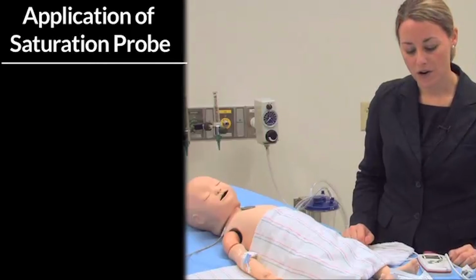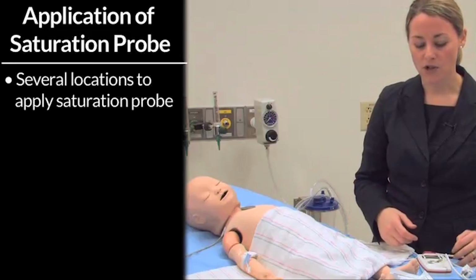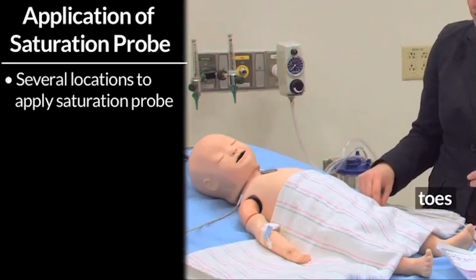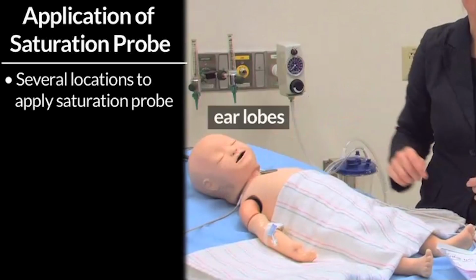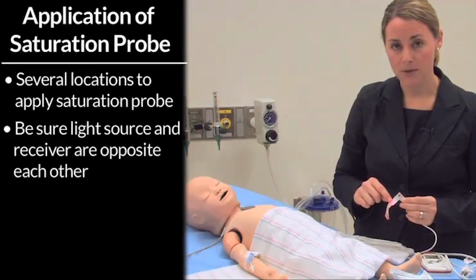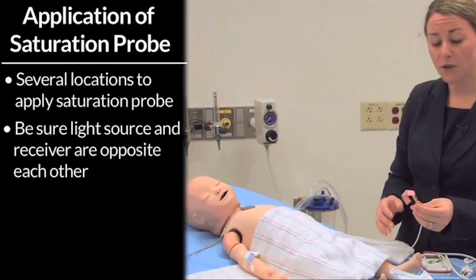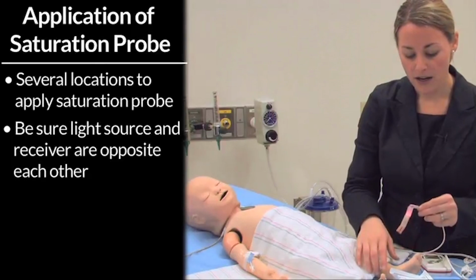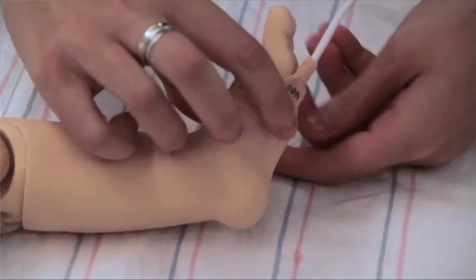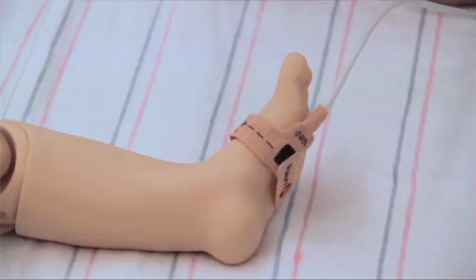When you go to apply your saturation probe to your patient, there are several locations that you will be able to use. In a small infant or child, you can often use the foot, the hand, toes, fingers, or even sometimes earlobes. The one thing that's most important to remember is that you must make sure that the light source and the receiver are opposite of each other, no matter where you place this. So for example, if I'm going to place this on the infant's foot, I want to make sure that the light source here and the receiver here are in direct communication with each other. I can then wrap the elastic around to make sure that it stays on this patient.